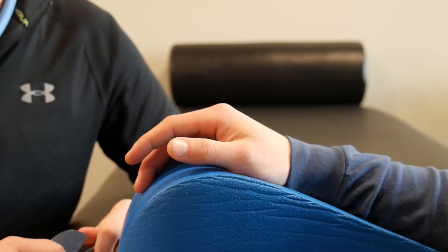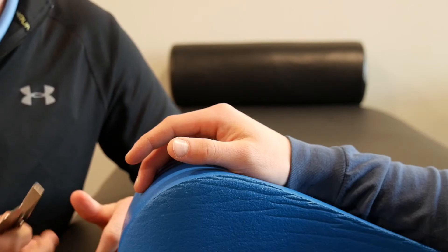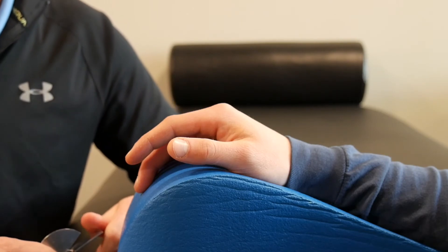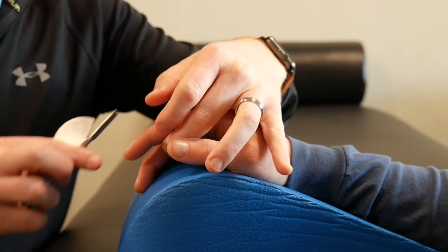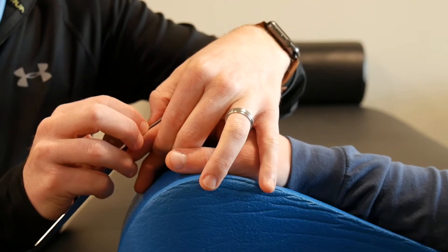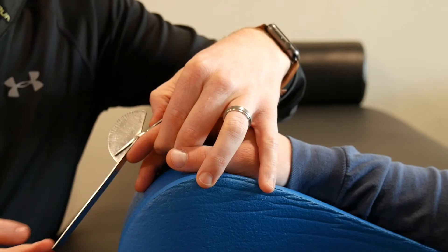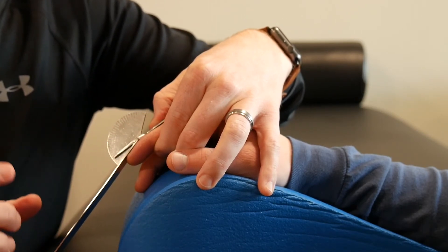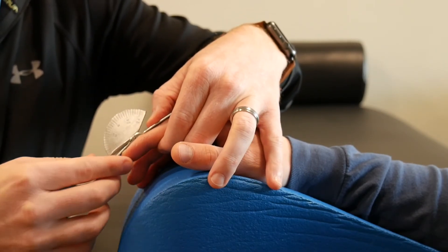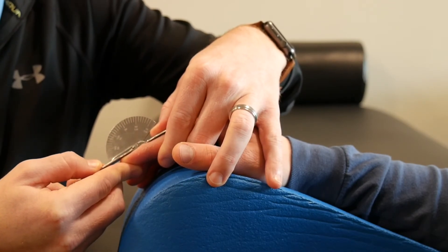Lastly, we're going to talk about DIP extension and how to measure that. We don't do this as frequently, but there are obviously instances where we do — mallet finger being one specifically. Same as all the others: lay the stable end right along the dorsal surface of the finger, in line with the middle phalanx, with the axis right over the DIP joint. Ask the patient to extend as best they can. If they're not able to get to zero, you would then take your passive measurement very similarly to how we took the PIP extension measurement passively.